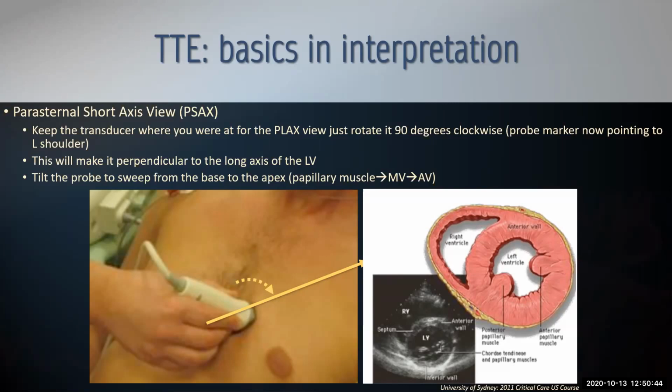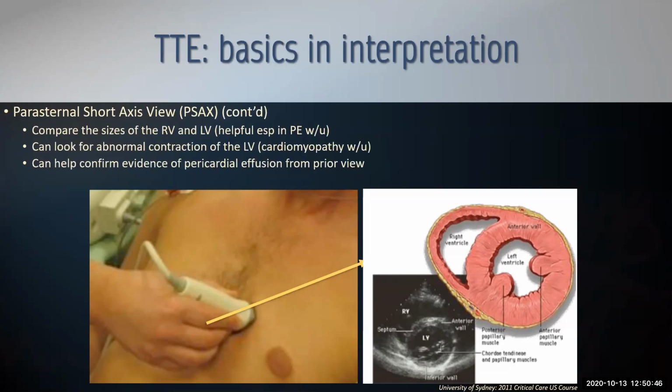Duffy or some of the residents there to kind of find out what patient it was and take a look. We are using the ultrasound from 1 to 1:30 at most, just until we get the pocket. So if you're looking for it and it's not there, just go to 3 Southwest and we'll have the ultrasound there. It allows you to compare the views as well, the right ventricle, left ventricle.